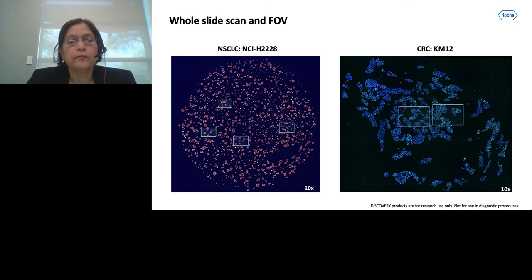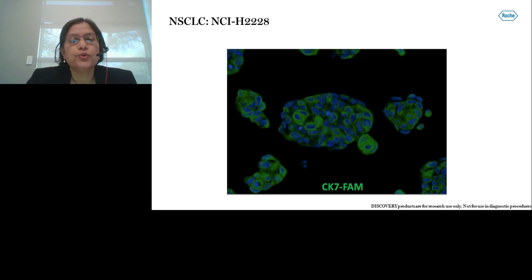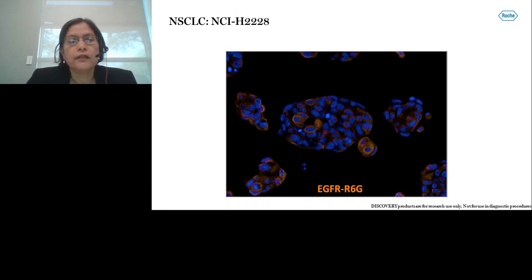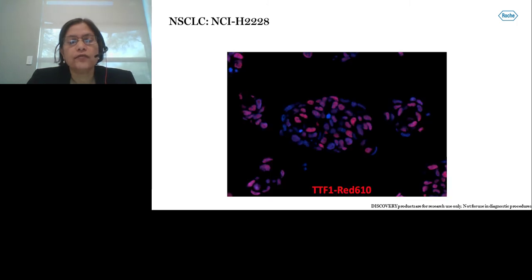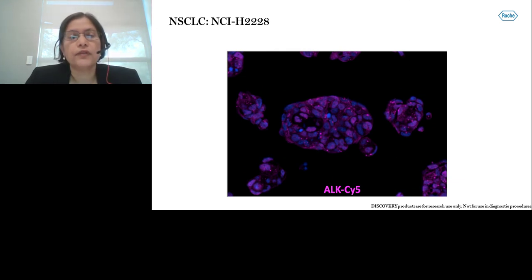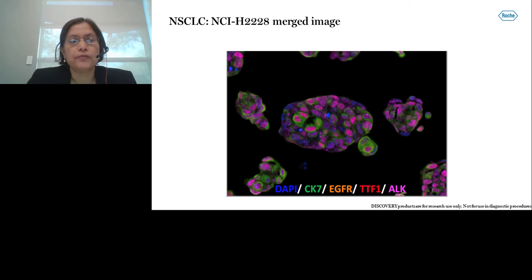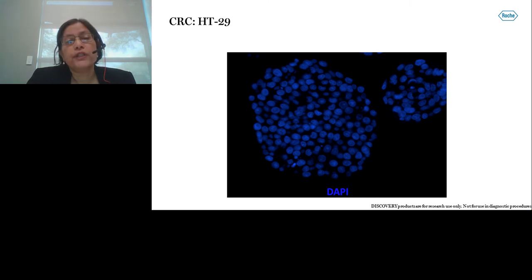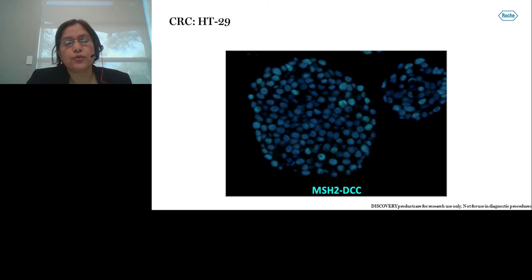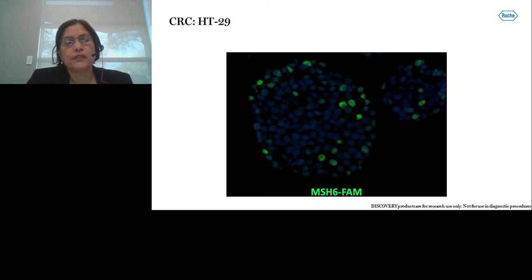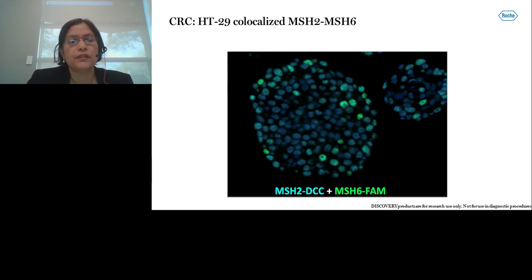Here is a whole slide scan taken at 10x, and we perform multispectral imaging of the field of view at 20x. Here is an example of H2228 showing CK7 stained with FAM, EGFR stained with rhodamine 6G, nuclear staining TTF1 with RED610, and diffuse ALK stained with OPAL 570, with a final merged image of H2228. For the HT29 sample, I will discuss coregistration of MSH2 and MSH6. The DAPI stain shows most nuclei are stained with MSH2 and DCC, whereas fewer are stained with MSH6 and FAM, and finally we get the co-localized MSH2 and MSH6 image.